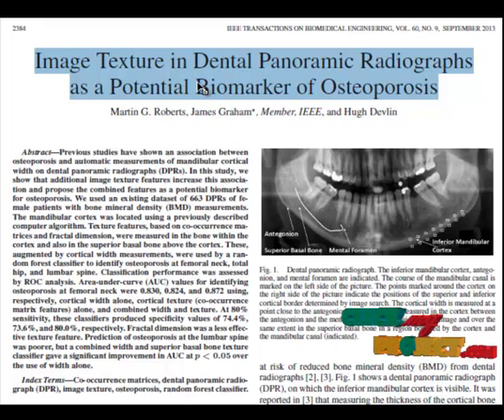Teeth classification is an important component in building an automated dental identification system. To classify the age of the image, we use the GLCM feature extraction in the literature, but we use a Gabor feature extraction instead of that. The existing system uses the GLCM feature extraction method and the CART method of classification.